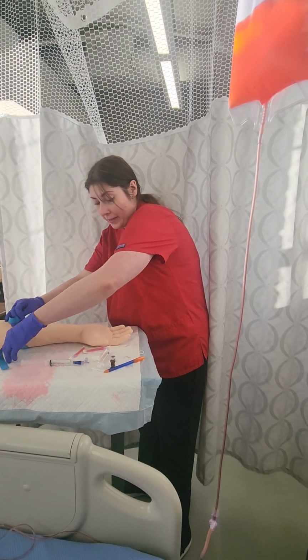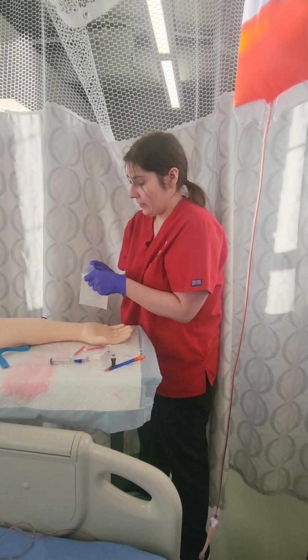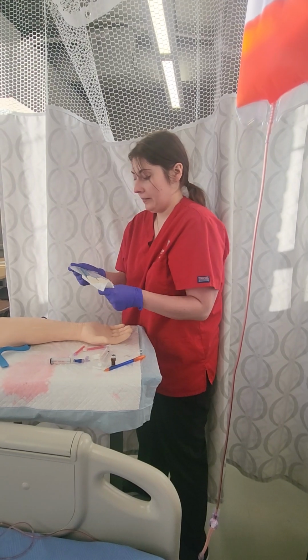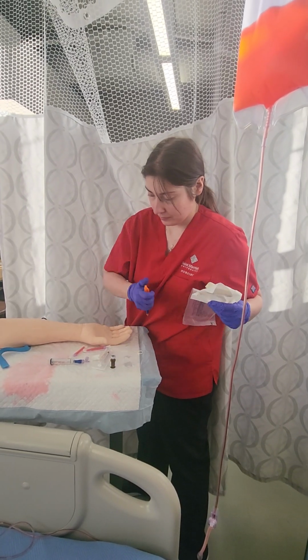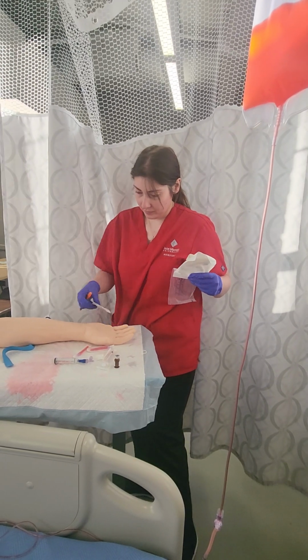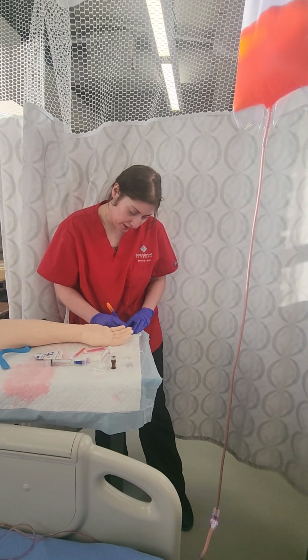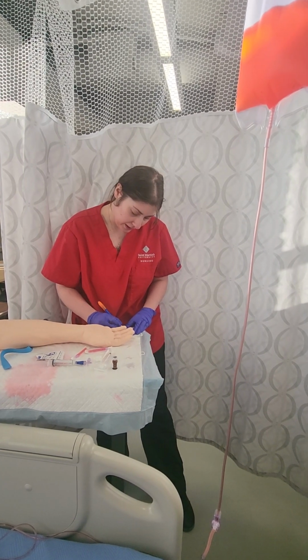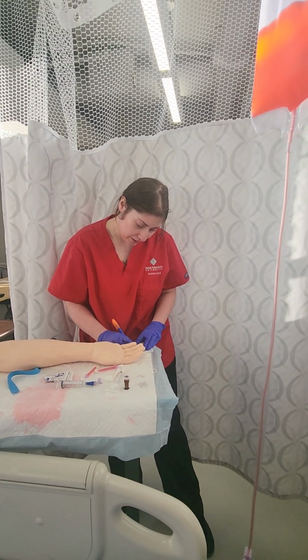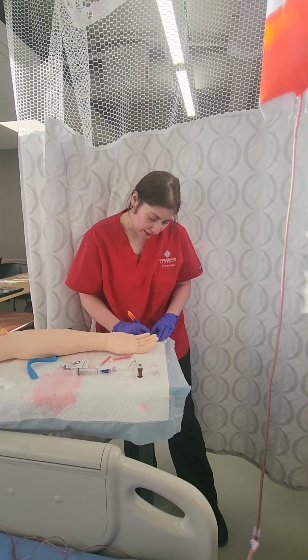Okay, are you ready? Yeah. Okay, well, one more sec. I'm going to get this ready here. And what I'm going to put here, that does not take any kind of writing very well. It's my gauge, which is 20, and the date and the time.